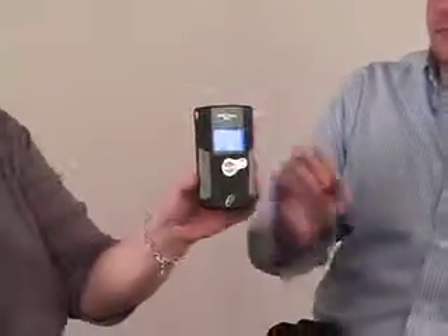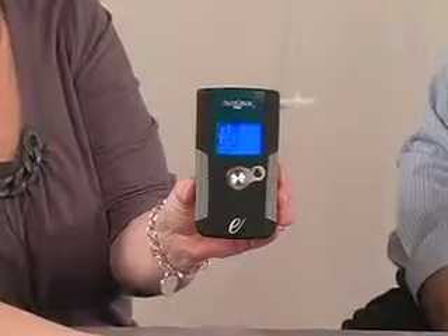The donor blows into the device, making sure not to block the breath exit hole. The donor blows until the device emits a single click, about 5 seconds.